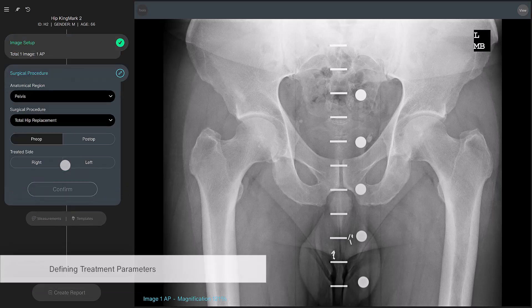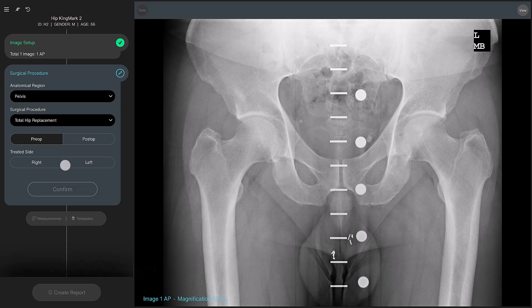The next step is the surgical procedure definition where you will review and define certain properties. The software has automatically detected the anatomical region as the pelvis region and is suggesting a total hip replacement. All you need to do is review these parameters, define whether it's a pre- or post-op image, and choose the correct treated side by selecting either right or left.